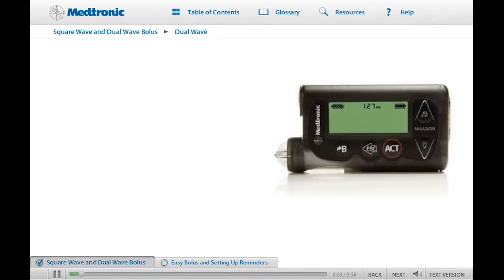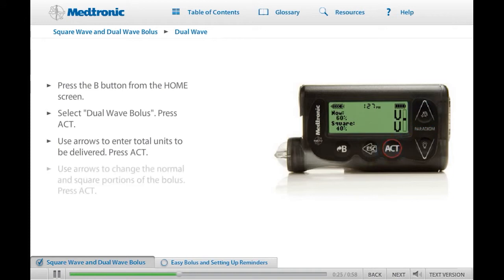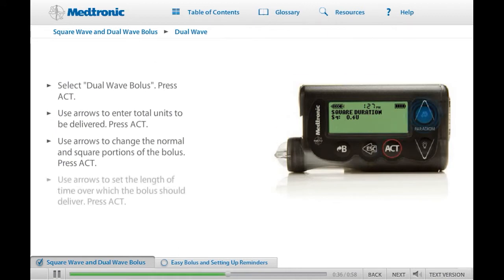For a Dual Wave Bolus, programming is similar. Press the Express Bolus button or select Set Bolus from the Bolus menu. Then select Dual Wave Bolus on the Bolus Type screen. The Set Dual Bolus Total screen will appear. Enter the desired amount for the total bolus units to be delivered and press Act. On the next screen, use the up and down buttons to change the normal and square portions of the bolus desired, then press Act. Now enter the length of time for the square bolus on the Square Duration screen. Press Act and the bolus delivery will start.